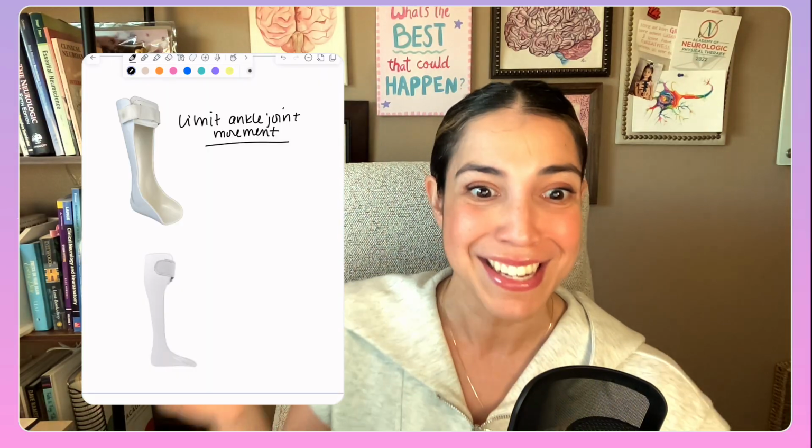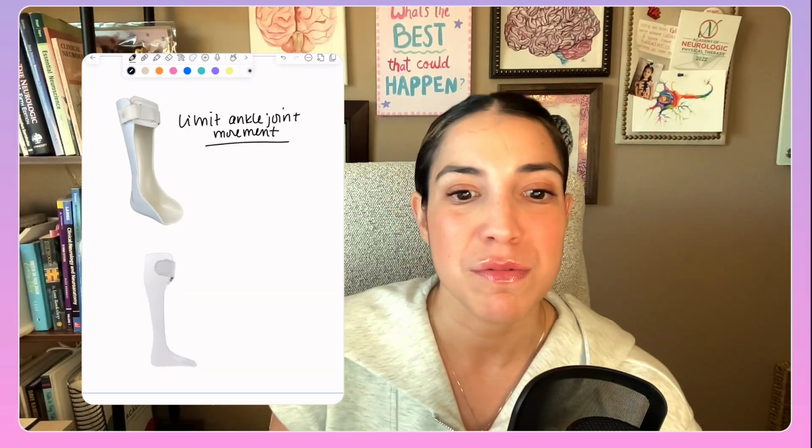So they're going to block a lot of that ankle joint movement. They're going to block dorsiflexion. So rising from a chair, ascending ramps, squatting, and descending steps are going to be a little more difficult, because they're so rigid that they restrict any tibia movement. So you must consider the negative effects on function when you are evaluating orthosis.